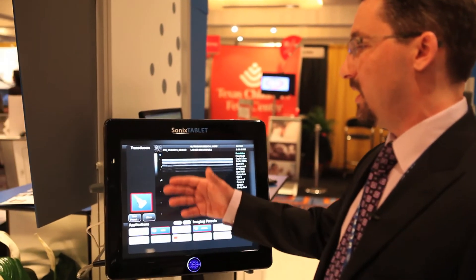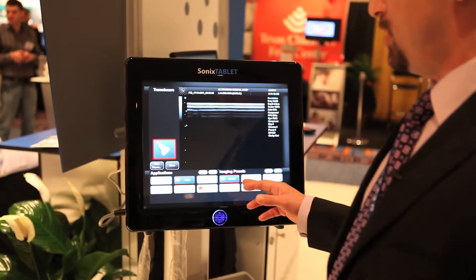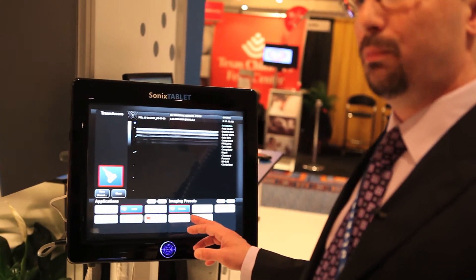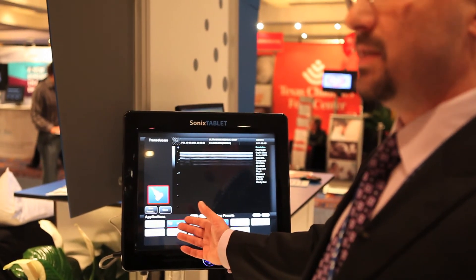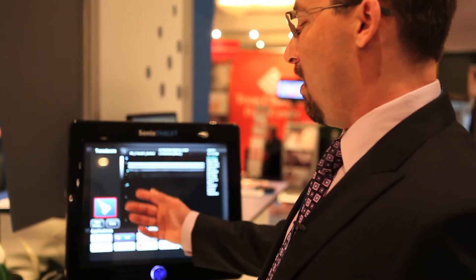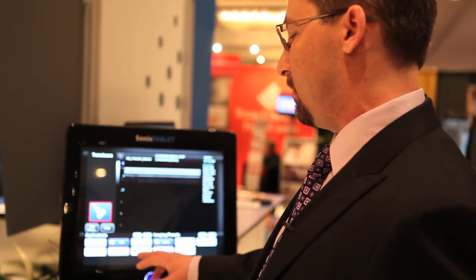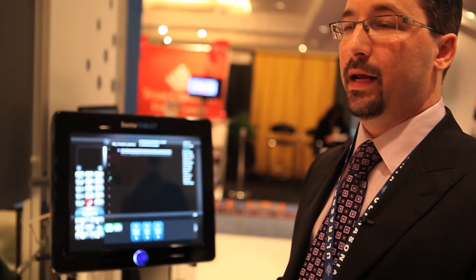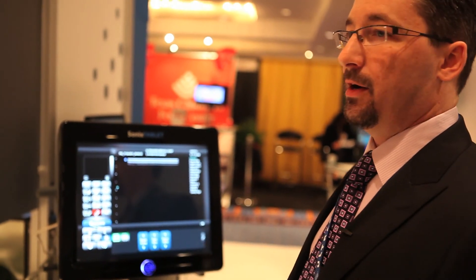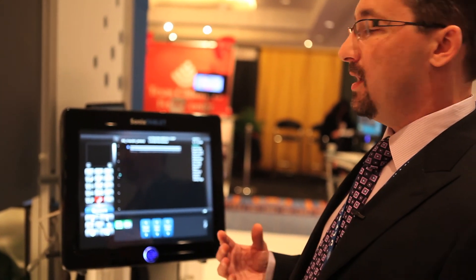Changing presets, selecting a different transducer, or changing the exam type is also very easy. For example, I'm in an MSK exam right now doing an ankle block — if I wanted to switch to vascular and do a general scan, I've just switched into vascular without having to re-input any patient information. It's a very simple system to use. Our position is that we provide premium imaging performance at a very competitive price in a very innovative package.